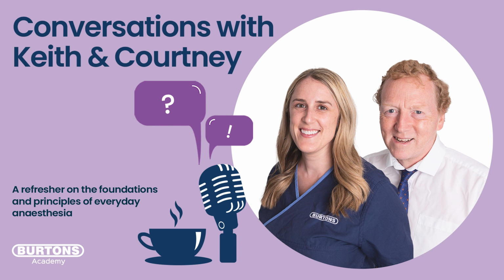And let's just think about the implications of getting that wrong the other way. So say it's excessive. Say for whatever reason you set it for 3 seconds inspiration. Well, what's going to happen? Well, it's still going to get a breath. It's still going to get delivered oxygen. It's still going to get delivered agent. But you're going to be creating pressure in that chest for longer than you would really want to. And that has implications that we talked about for the effect on venous return. So there's your downside to a prolonged inspiration.